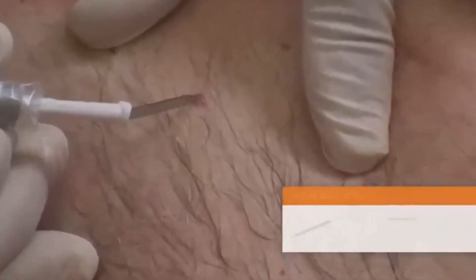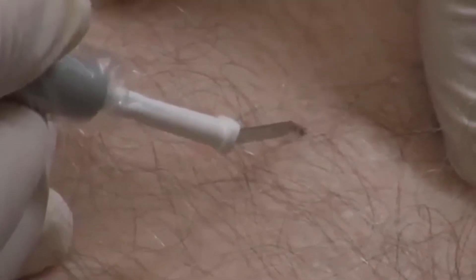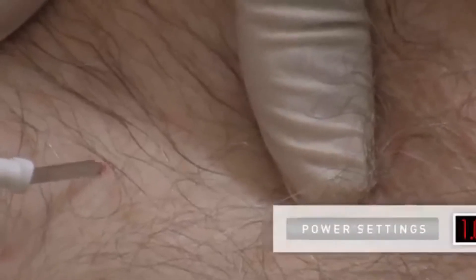For lesions larger than 2 millimeters, the ARIN 940 high-frequency desiccator with an A804 sharp dermal tip electrode is recommended. Always start with a low power setting and increase power as needed.